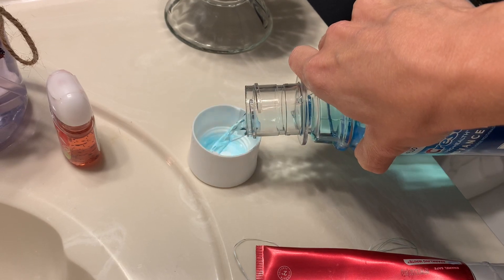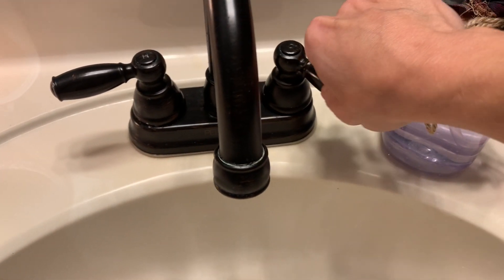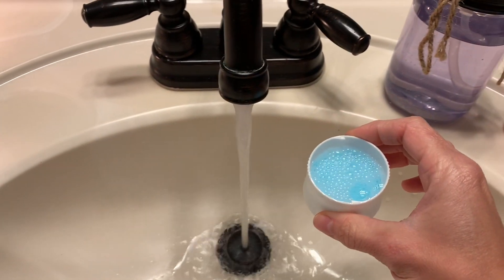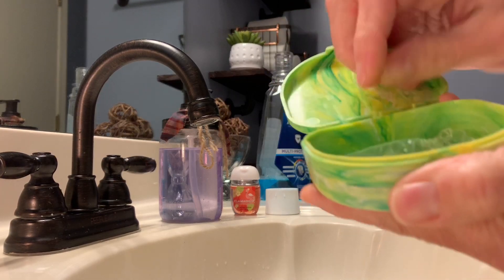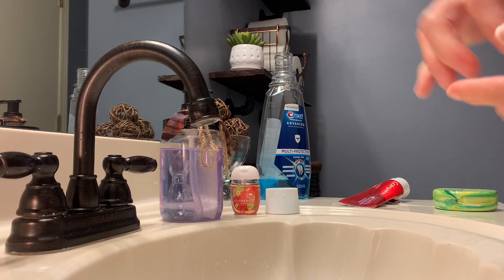Lastly, I take my Crest mouthwash — part mouthwash and part cool water. Make sure you're using cool water because you do not want to damage your retainers by using water that's too hot.